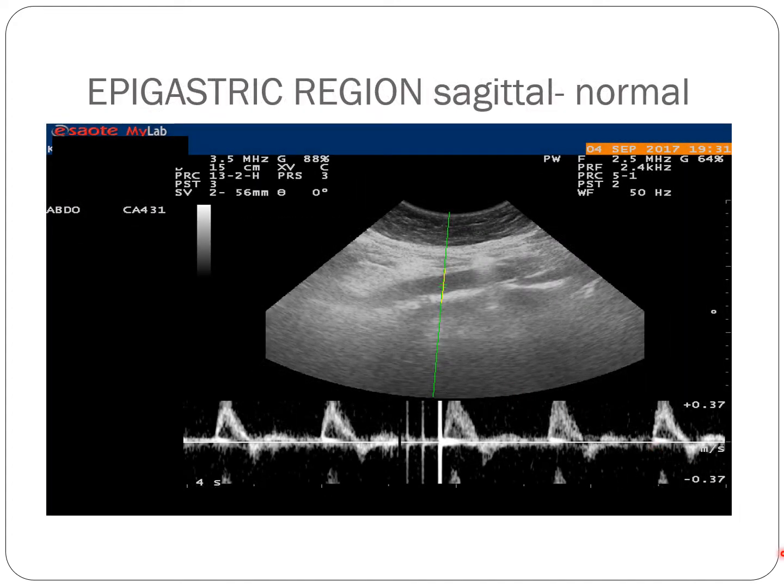The abdomen can contain a lot of pipe-looking structures. So if you're unsure what you're looking at, you can put the Doppler on, and if you can see the trace of the heartbeat, you can be sure that you're looking at the aorta.